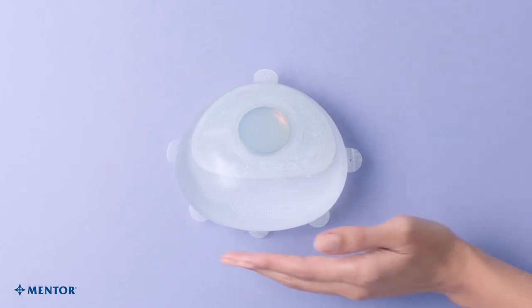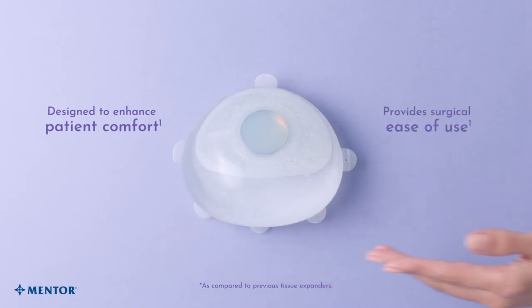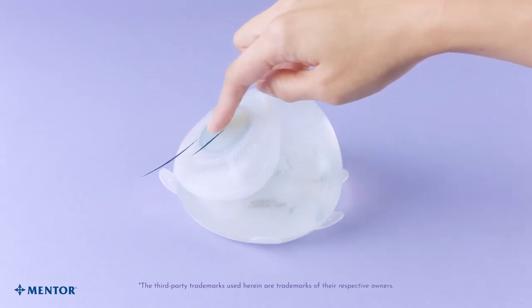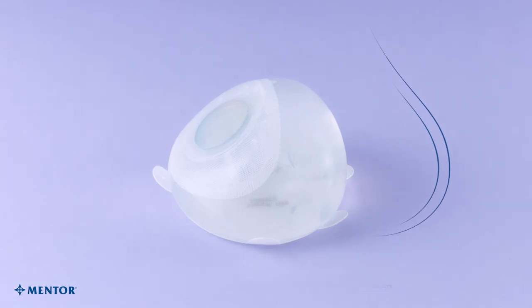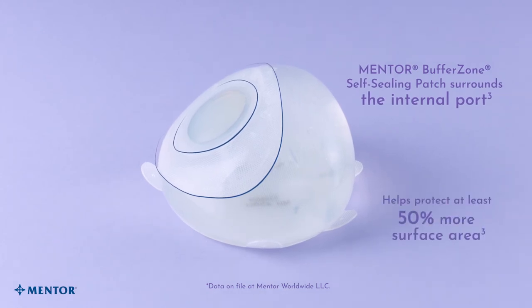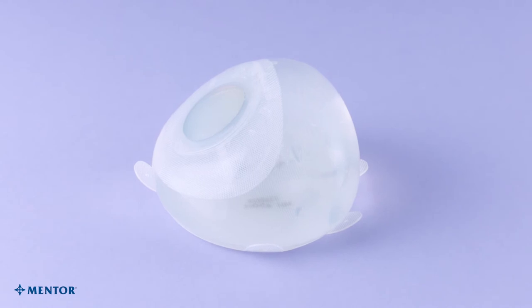Our CPX4 Breast Tissue Expander is designed to enhance patient comfort and helps facilitate surgical ease of use. The Proprietary Buffer Zone Self-Sealing Patch and the Dacron Patch drive lower pole expansion to mimic the shape of a natural breast. The Proprietary Mentor Buffer Zone Self-Sealing Patch surrounds the internal port and helps protect at least 50% more surface against accidental needle puncture and expander deflation during post-operative fills.